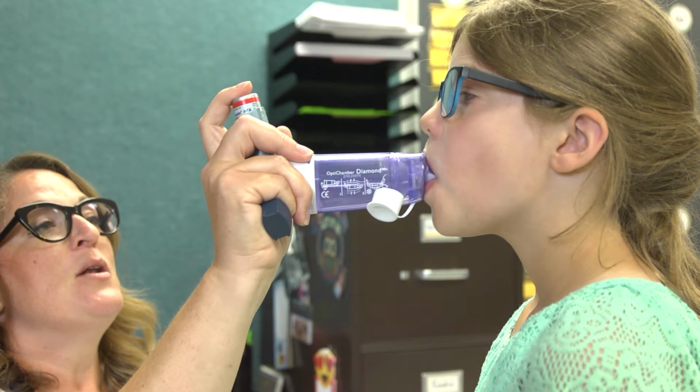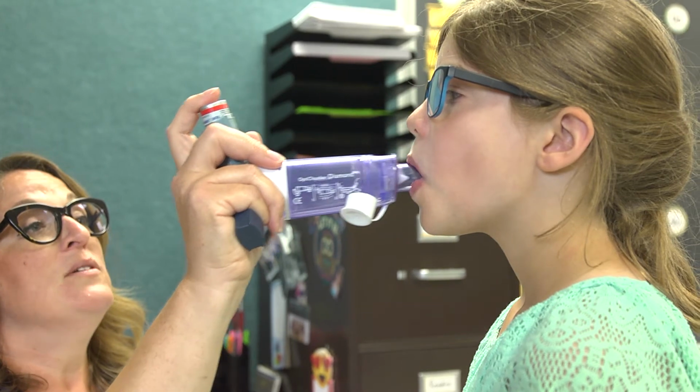The breath in should take at least 3 to 5 seconds. Instruct the student to hold their breath for 5 to 10 seconds. Instruct the student to breathe out slowly through their mouth. Wait 1 minute before having the student take a second puff if ordered. Repeat earlier steps if taking a second puff.